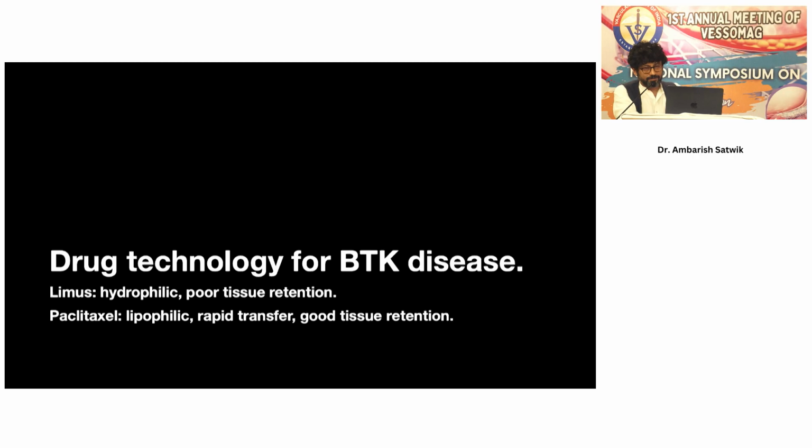I wasn't there, unfortunately, for Dr. Devendra's presentation yesterday, but the history of drug-eluting technologies, particularly below the knee, counterintuitively starts off with drug-eluting stents. So drug-eluting stents came first, and they were largely limus-based, not largely, entirely limus-based, and then drug-coated balloon technology happens later. You would think that DCBs come first and DES comes later, but it happens in the reverse way.